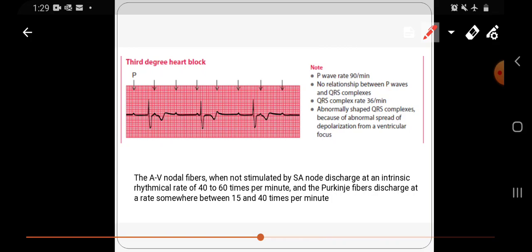هلا let's see this ECG strip. هلا هون زي ما انتم شايفين هون حاطين لنا arrows على أماكن وجود ال P waves. فال P waves they are equally distributed. ولو حسبنا ال atrial rate وبهاي الحالة بنحسبه من خلال ال PP interval رح يطلع تقريبا 90 beats per minute. اوكي هلا بالنسبة لل QRS complex هي هون لو أخذنا إحنا بين هاي ال QRS وهاي ال QRS وحسبنا الريت رح يطلع الريت تقريبا 36 beats per minute.